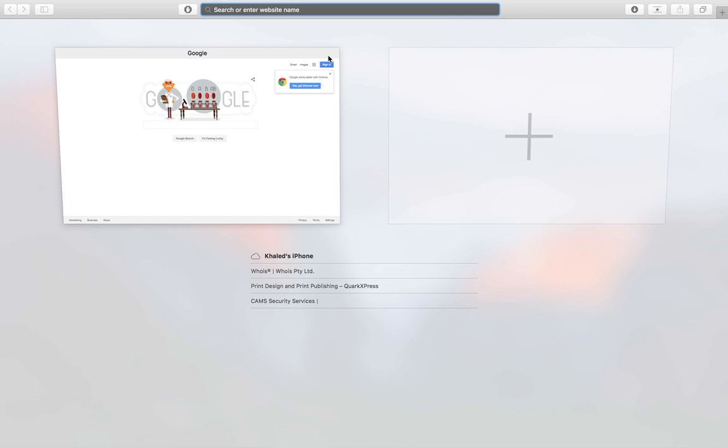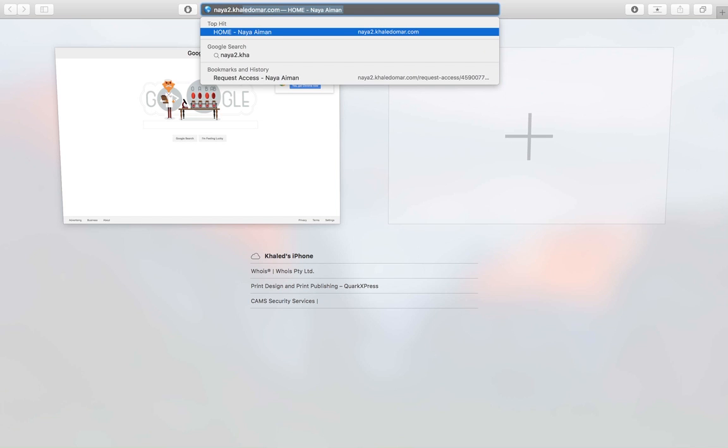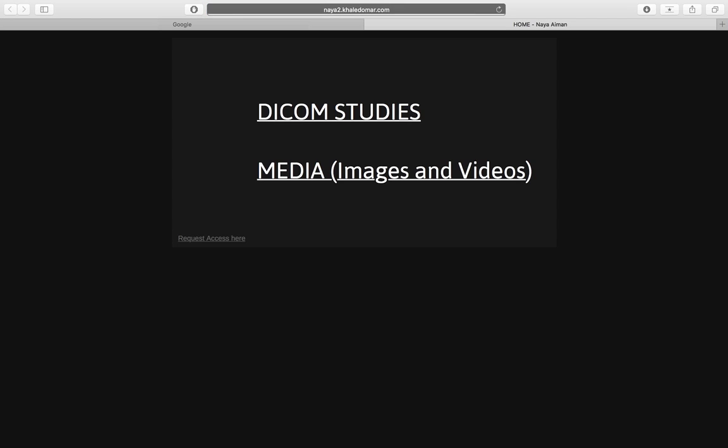To access Naya's DICOM system with images, pictures, and videos, you just need to browse to naya2.khaledoma.com on your internet browser. You'll be redirected to the main page where there are two options.